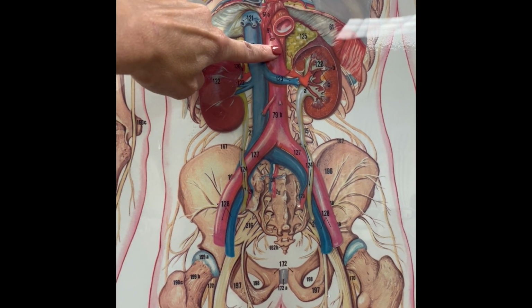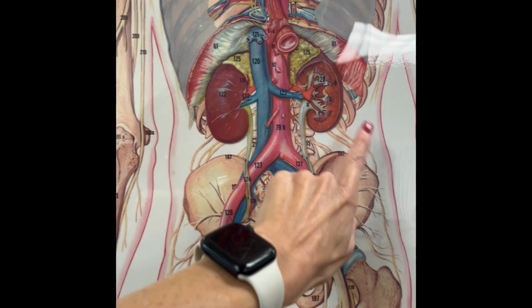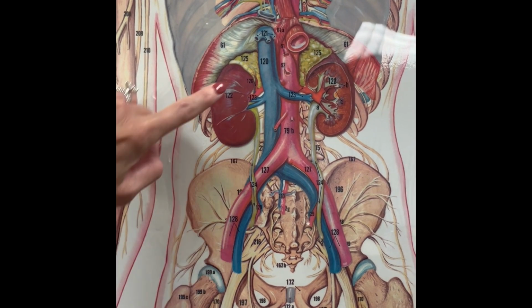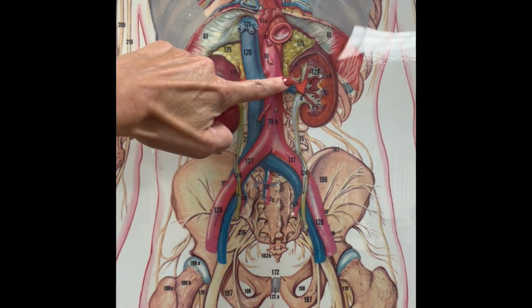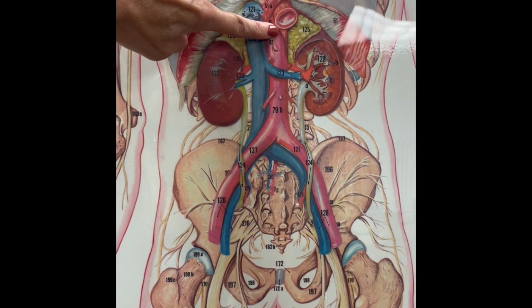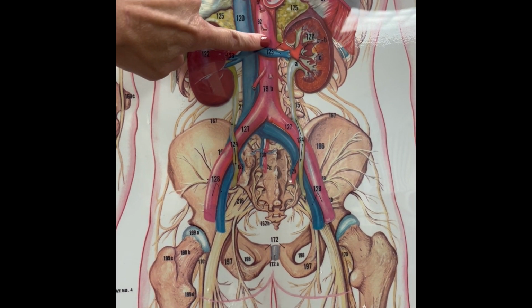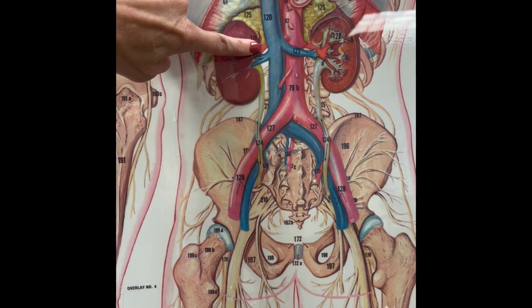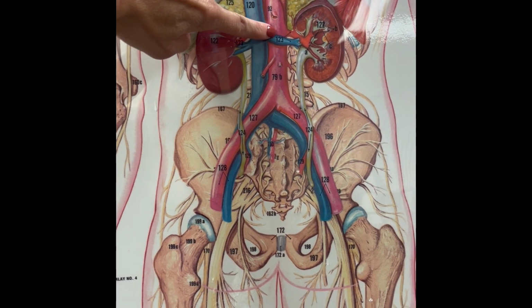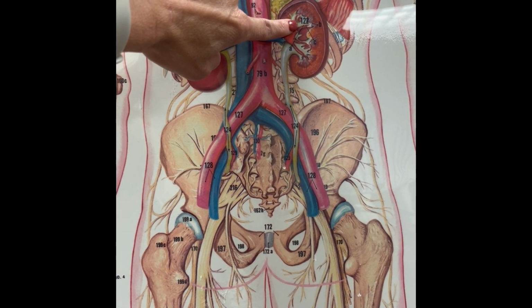After listening to the aorta, you're going to move down to listen to the renal arteries. As you can see, the kidneys are here. However, we're not listening to the kidneys themselves, we're listening to the renal arteries, which are these very small arteries branching off of the aorta. So after you have come down from listening to the aorta, you're going to move your stethoscope on your patient's abdomen down just about an inch and then out an inch. Here we have our patient's right renal, and then moving back to center and then an inch off center to the left, we're able to listen to the left renal.